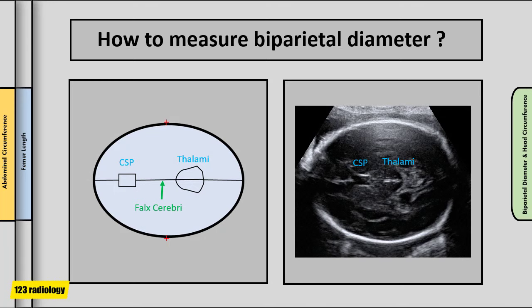To obtain an ideal image for biparietal diameter measurement, get a cross-sectional view of the fetal head at the level of the thalami. The head should be as close to horizontal as possible, appear oval in shape, and show symmetry on both sides. The falx cerebri should be centrally positioned as a continuous midline echo, broken anteriorly at one-third of its length by the cavum septum pellucidum. The thalami should be located symmetrically on each side of the midline. The cross-section should fill at least 30% of the monitor, with calipers placed outer-to-outer at the widest part of the skull.